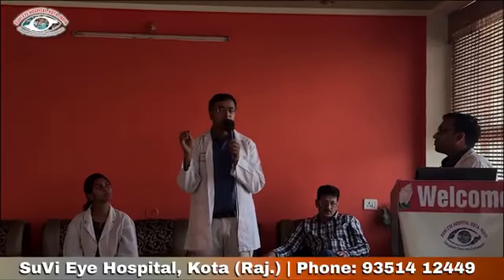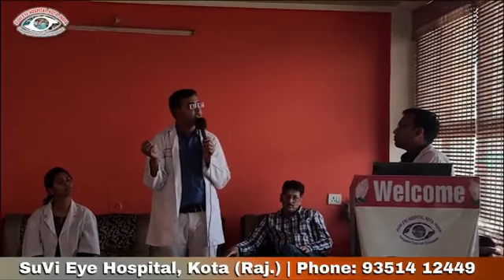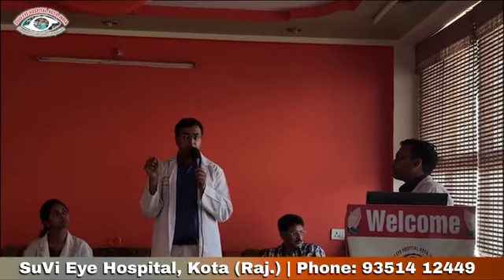One more important point in young patients with vasculitis, particularly Eales disease. Eales is very aggressive. Like Dr. Shankar Vishwanathan also used to say, between the laser marks, NV can crop up. Eales is such an aggressive disease. So Eales should have a tight PRP, panretinal photocoagulation, and we should also give anti-VEGF.